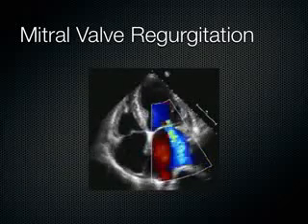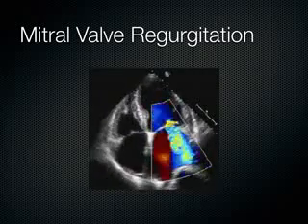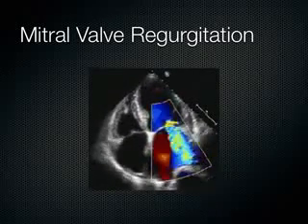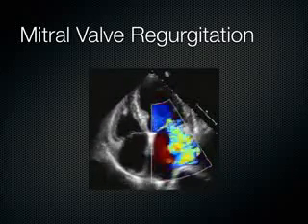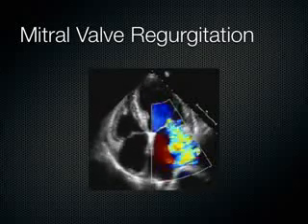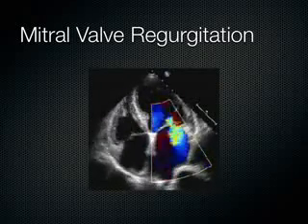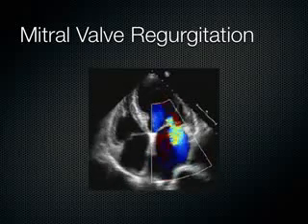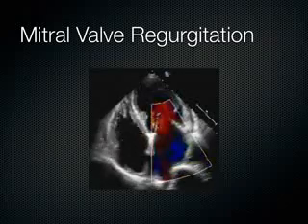And we do this in the apical 4, not the parasternal long, because recall that when you work with Doppler, you don't want the Doppler to be at a 90-degree angle with the angle of insonation. In the parasternal long axis, when you look at the mitral valve, you're at about 90 degrees, whereas in the apical 4 chamber view, you're closer to more parallel. The sound is more parallel with the flow of the blood, and you're closer to an angle of maybe 60 degrees or even less, even 45 degrees. So that's the idea. The more parallel you get, the better Doppler works.